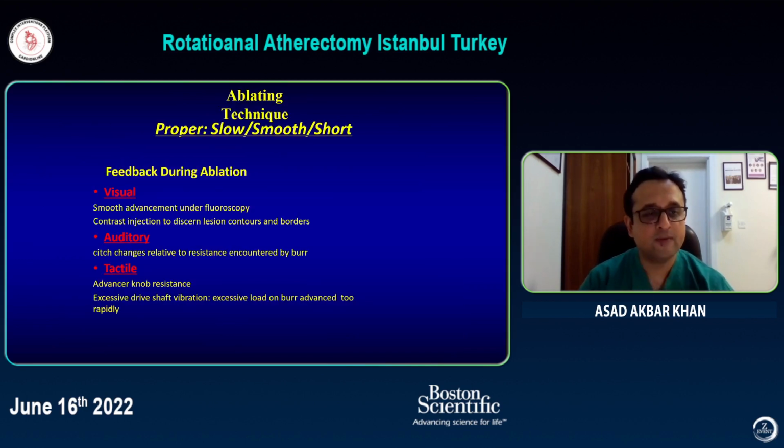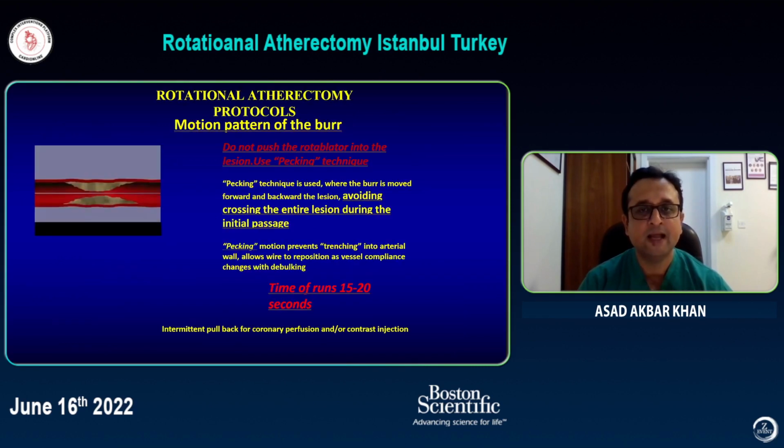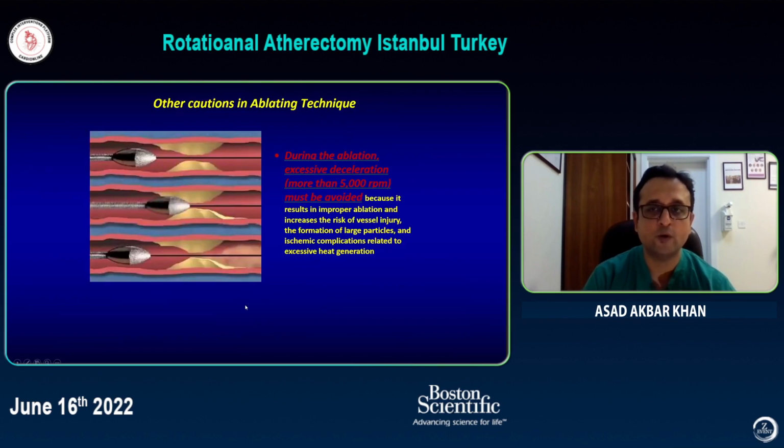So obviously, always look for visual, auditory, and tactile stimuli while you're doing it. Make sure you're not pushing the rotablator in, like Professor Shefkat said, always use the pecking technique, and try to keep your runs to less than 15 to 20 seconds in one go.